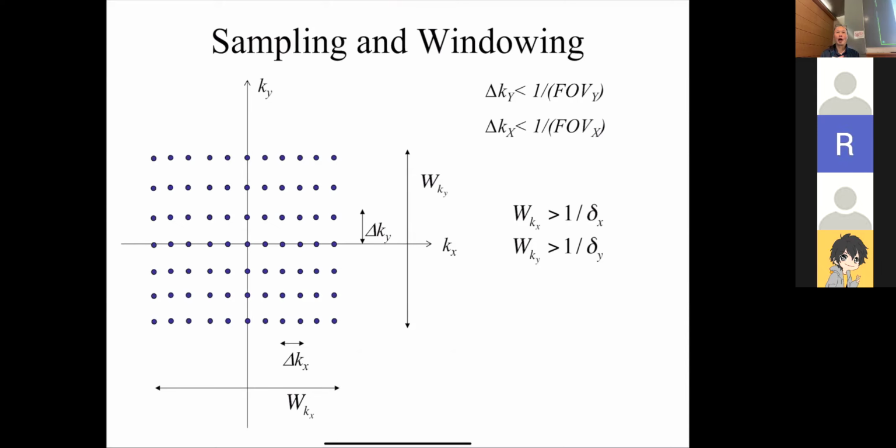Yeah, I guess what I would say is almost anything is possible. So if you want to try it out, that'd be an interesting experiment. You could look at nonlinear gradients, something called O space, they're like K space, and there's different things. We're just doing the most basic one, but there's variations that you could think about.